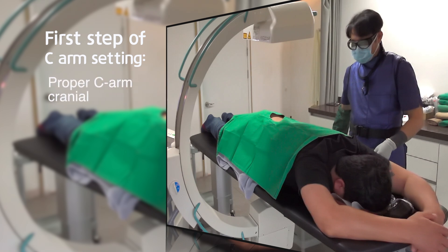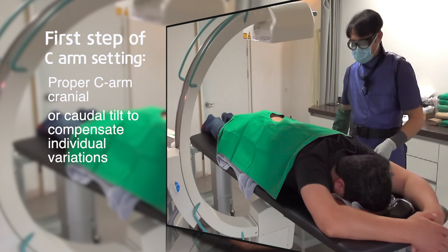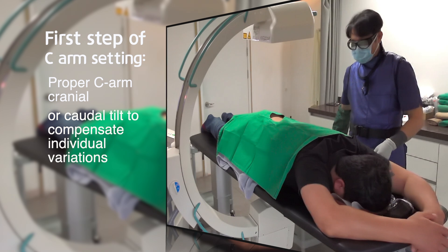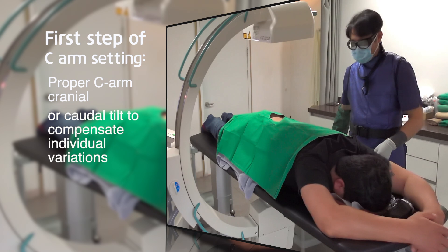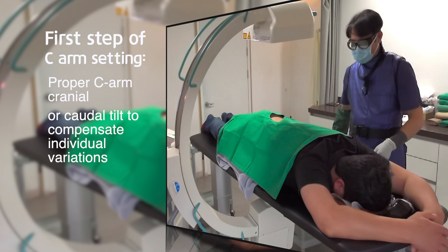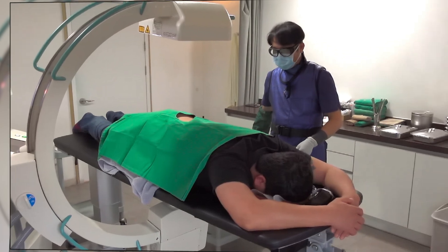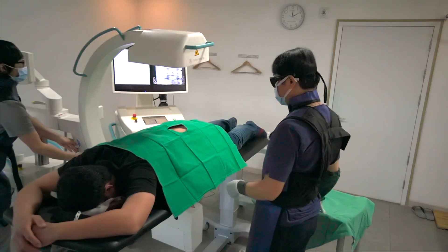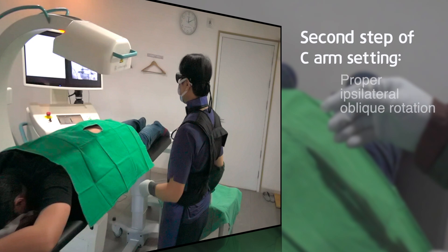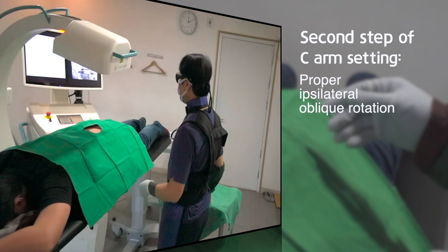Proper C-arm setting is crucial for successful intervention. After the patient is placed in the prone position and preparation and draping are done, optimal C-arm cranial or caudal tilting is the first step of C-arm setting. Its purpose is to compensate for individual variations of lumbar lordosis or segmental angulation. The second step is to rotate the C-arm to the affected side. With this maneuver, the operator can recognize the target and plan the needle trajectory.